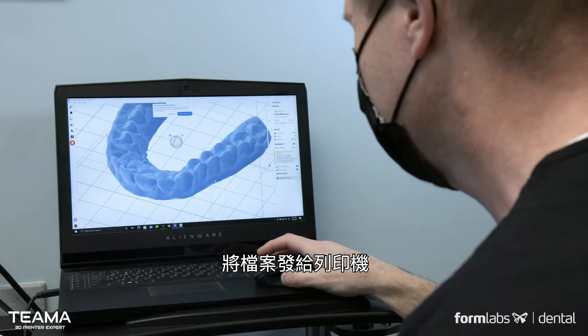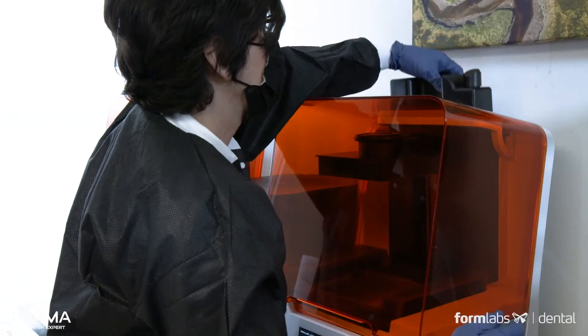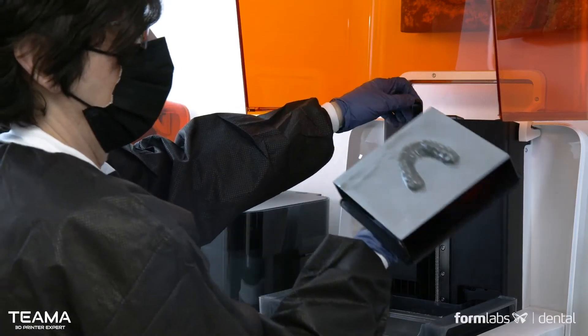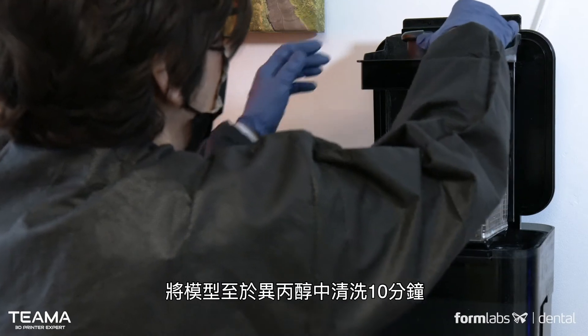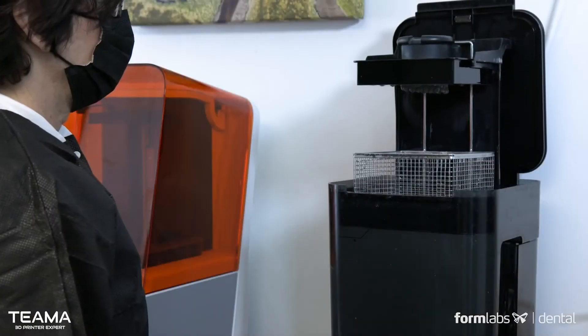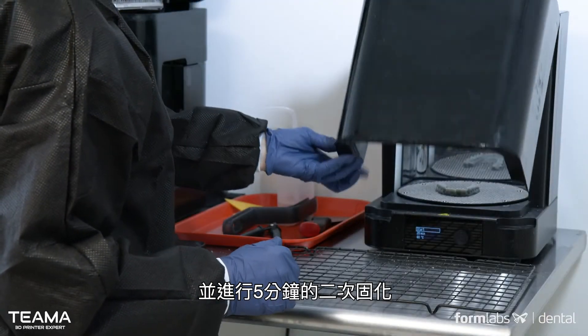Send the file to the printer and with draft resin, it will be done in less than 20 minutes. Wash the model in isopropyl alcohol for 10 minutes, and post-cure takes just 5 minutes.